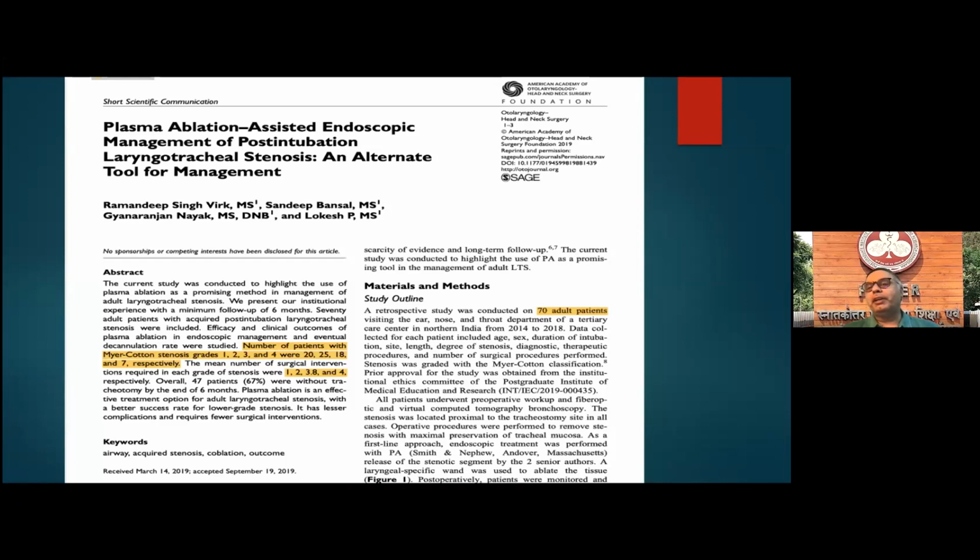The reason we called it an alternate tool was that laser, like Sohit said, is very expensive. Even in India, very few centers will have a good carbon dioxide laser. We have it at PGI, Dr. Alok has it at AIIMS. A few of the private practitioners have the carbon dioxide laser, but it is a tool which is not easily accessible and available.